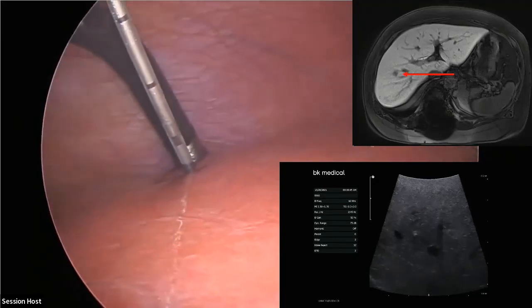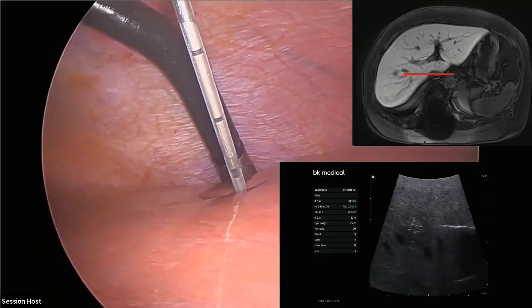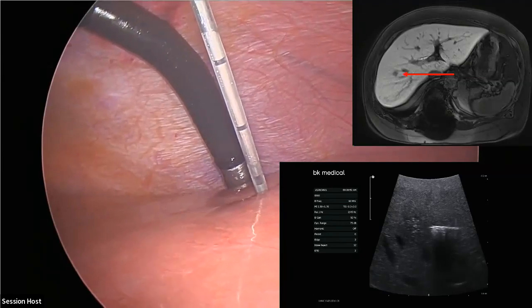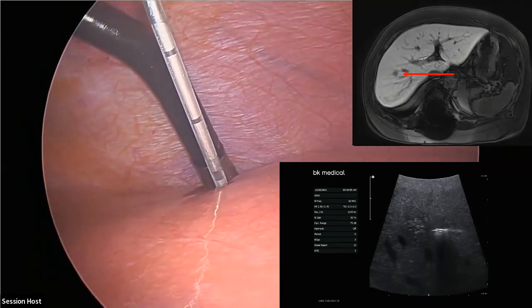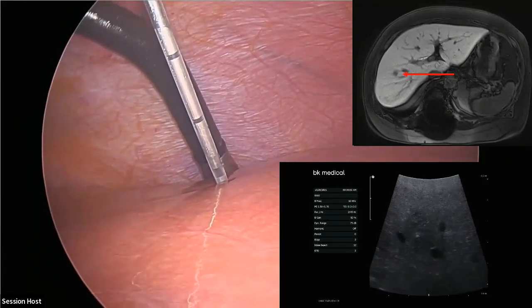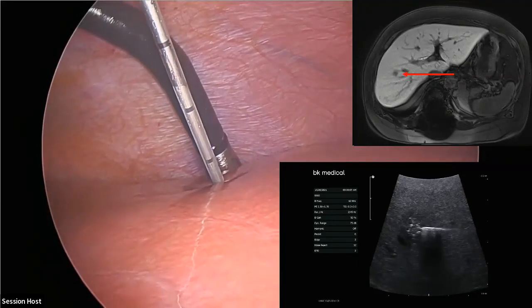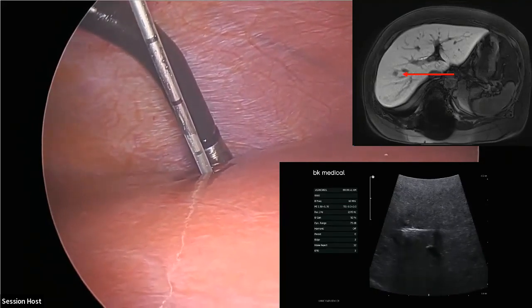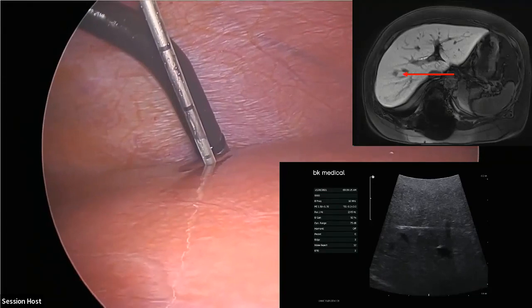I didn't try to make it really pretty. You can see I'm moving the needle around and things. But basically the principle of it is using ultrasound to identify the needle. So you can see the tip of my needle, you can see the target. And in this case, the nice thing about ultrasound is you can really see well in most cases. It's hard if somebody's got steatosis, real fatty livers, small tumors. That makes it a lot harder because the liver is more echogenic. But for a normal standard, the anatomy that you can see with the liver is super clear, super good.